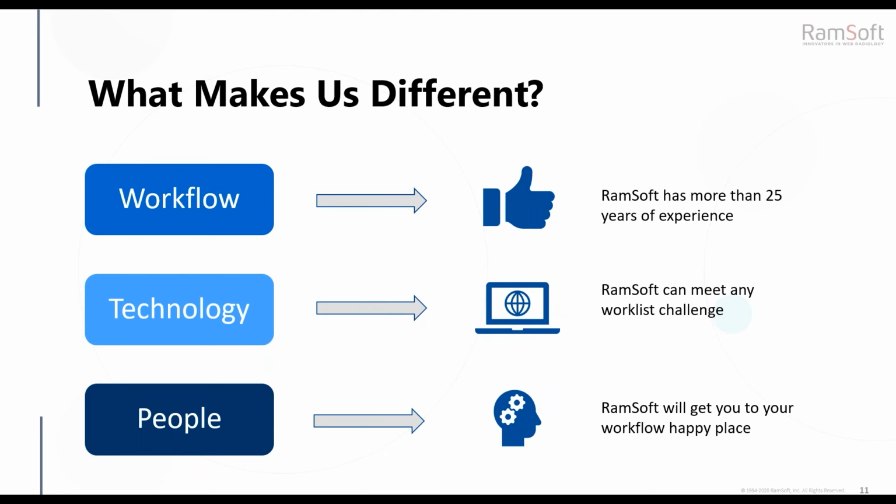So what makes us different? What are the key differentiators with Ramsoft? Well, there's a few of them. There's all kinds of them, actually, but here's just a few. Workflow is one. Ramsoft's been providing workflow efficiencies for more than 25 years. So you can configure a workflow that best suits your practice and then easily modify it as your requirements change. Maybe you add another location, or you want to change up your workflow a little bit. You're thinking, it might be a little more efficient if we do this, or drop a step in the process, right? It's always nice if you can drop a step in the process and increase your efficiency that way.